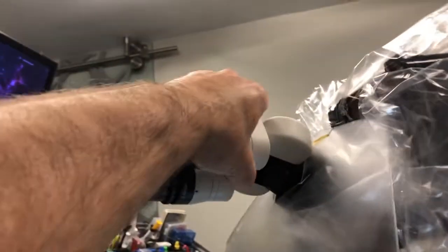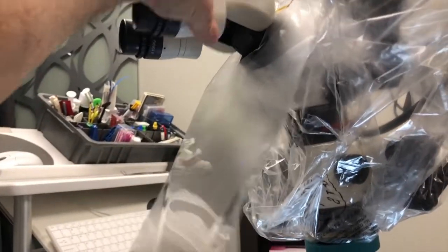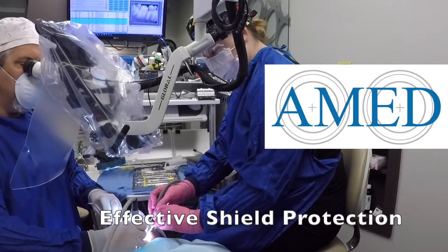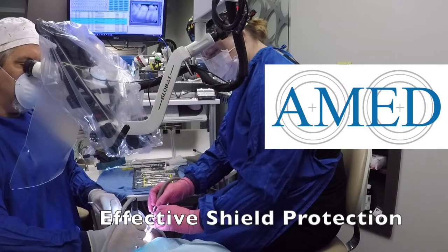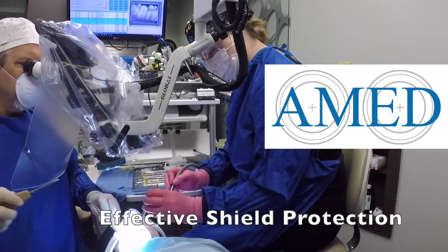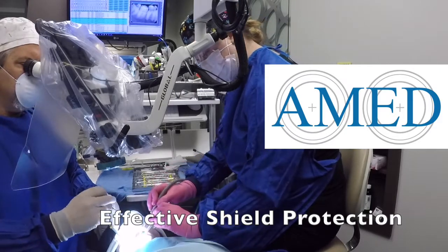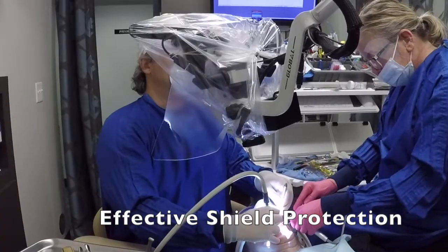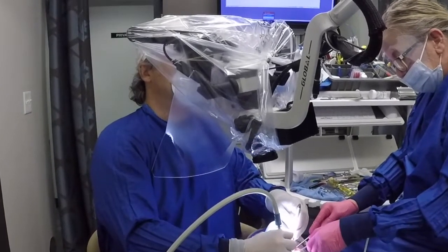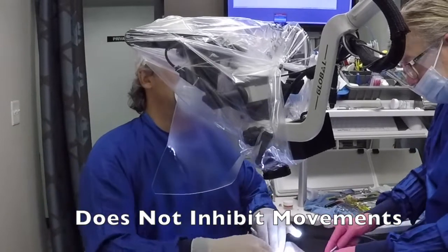As you can see it rotates with the rotating ring here. The shield provides excellent protection from droplet spray from either high-speed handpiece or ultrasonic. And most importantly it also does not block the movement in and out of the working field. A shield like this does not block instrument passing from the assistant either.